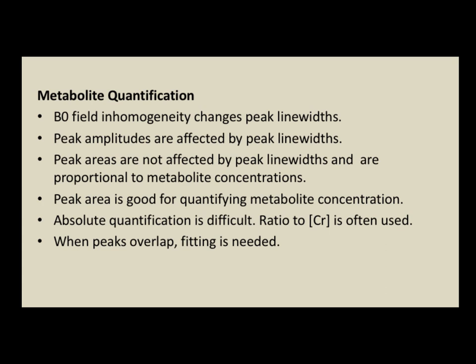So how do we quantify metabolite concentrations? B0 field inhomogeneity will broaden the peaks, but it will not change the peak area. So when a peak is broadened, the peak amplitude will reduce, but its area will not change for the most part. So peak area is a good standard for quantifying metabolite concentration.